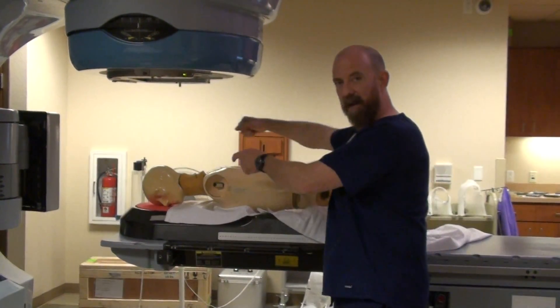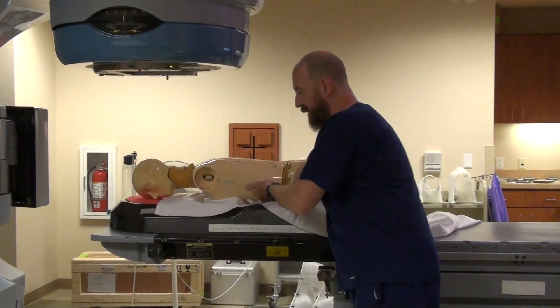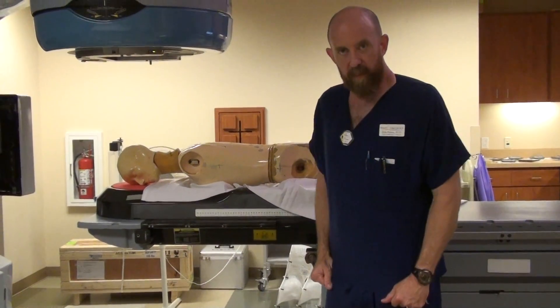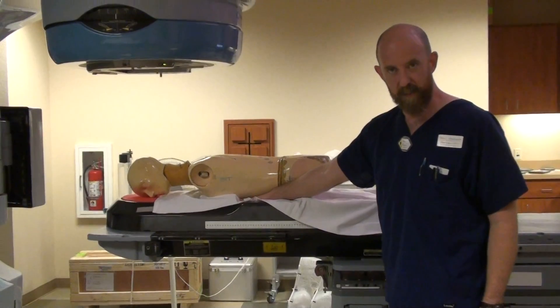If the patient is wearing a gown, make sure it's on backwards. As the patient lays down, make sure that gown gets stuffed down in there. Make sure their knees aren't on it and that it doesn't hook around their shoulders, which would pull it tight. You don't want that to happen, so make sure it's pulled down in here.